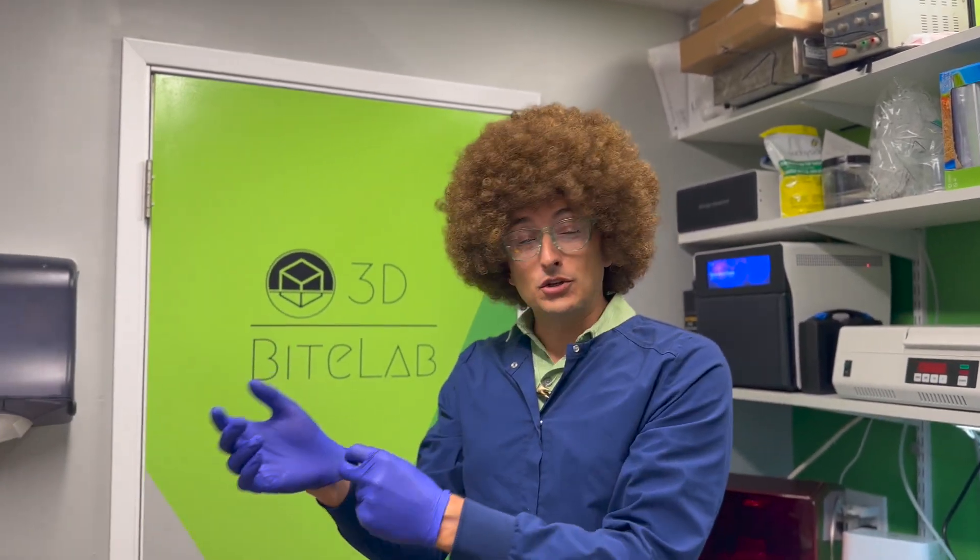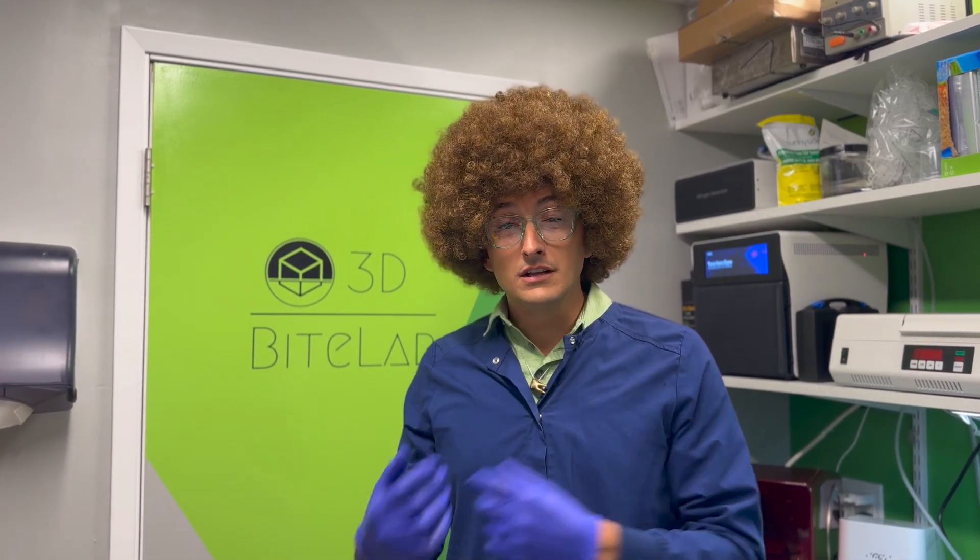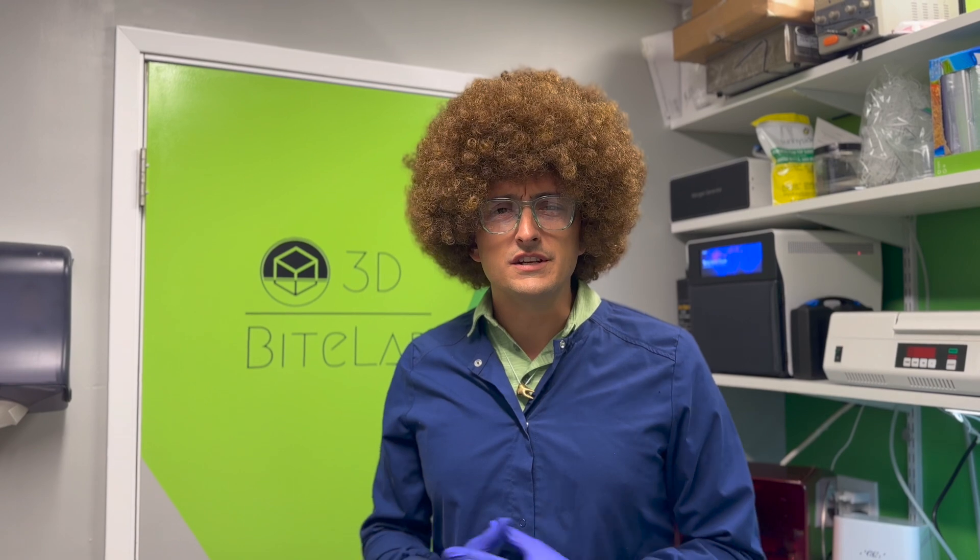The first step in pretty much any 3D printing post-processing work will be to don your PPE. These can include things like gloves, goggles, masks, and lab coats. We're all used to doing things at this point, but it's important to be safe.